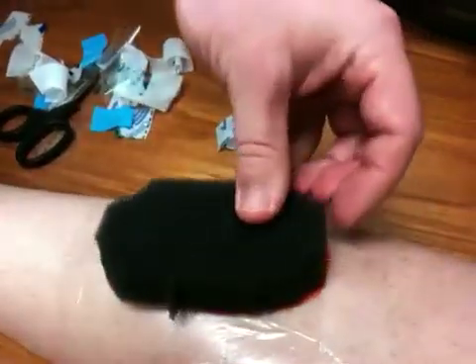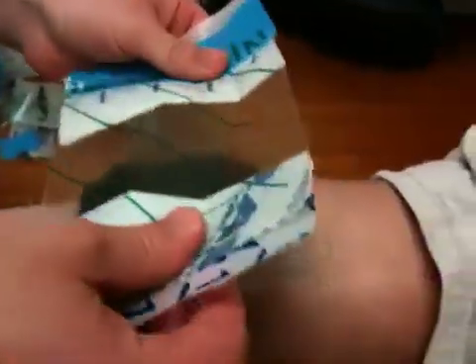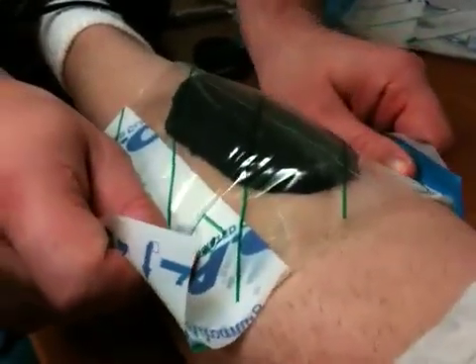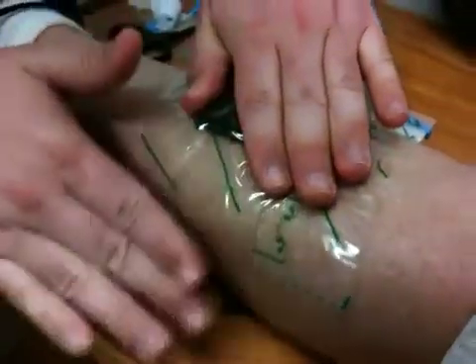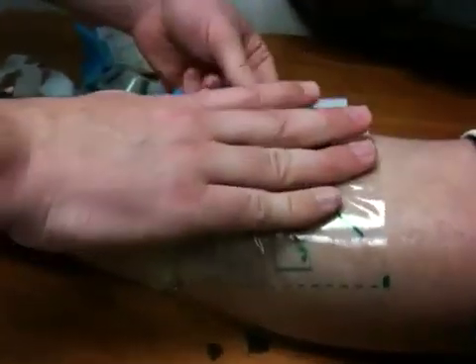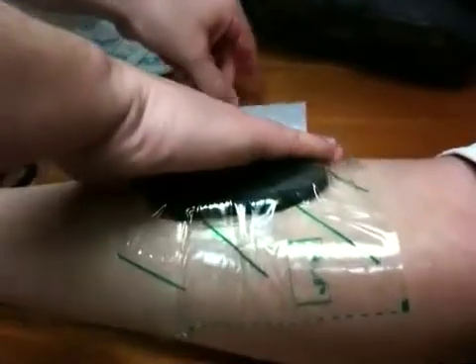This further prevents the potential for maceration of surrounding skin. When the top cover is placed over the sponge, it is important to do so in a manner which allows a flat and uniform contact across the sponge and skin. By preventing wrinkles, tracks, or cigar rolls, one can minimize leakage and non-uniform distribution of negative pressure.